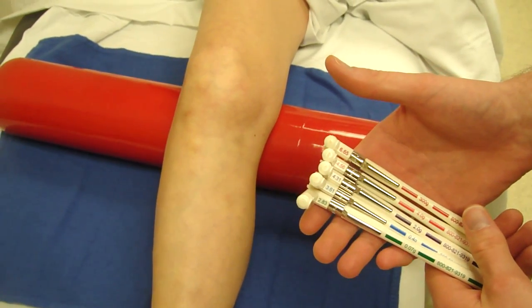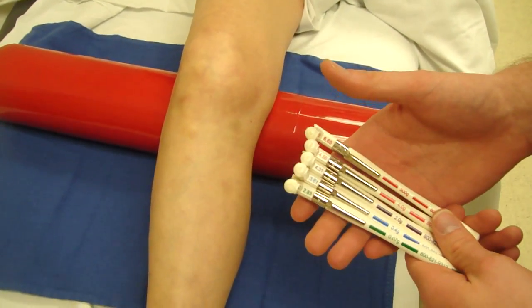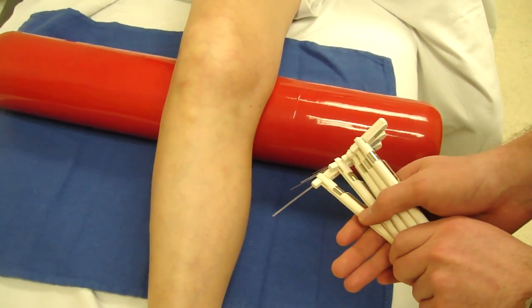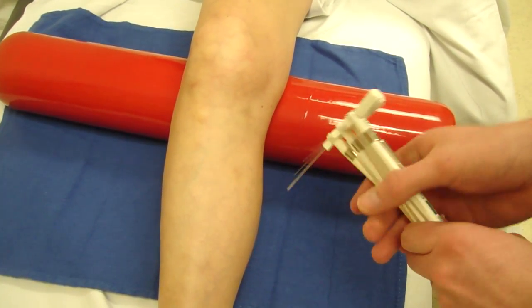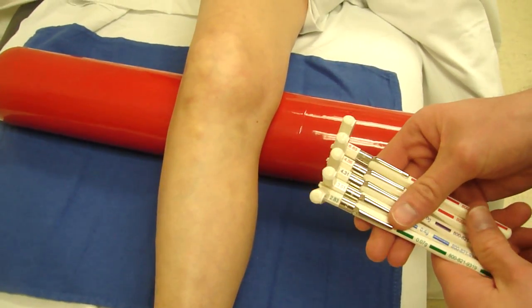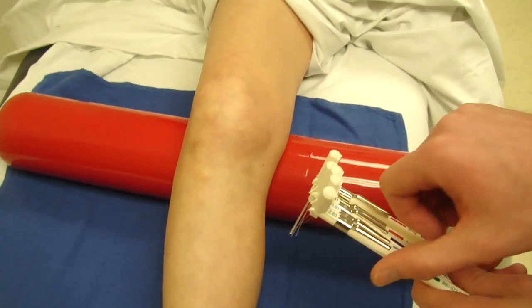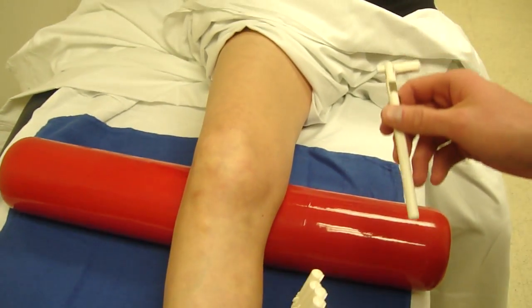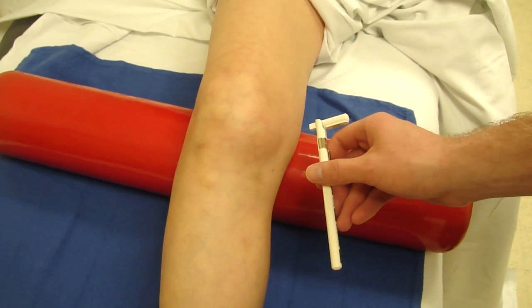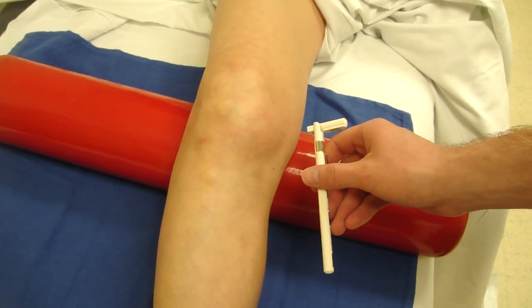Mechanical detection threshold is measured using a standardized set of modified von Frey filaments as described by Roelke in 2006. The assessment may be done at the site of most pain. The filament is pressed at a 90-degree angle to the skin until the filament bows slightly and is held there for approximately 1.5 seconds.